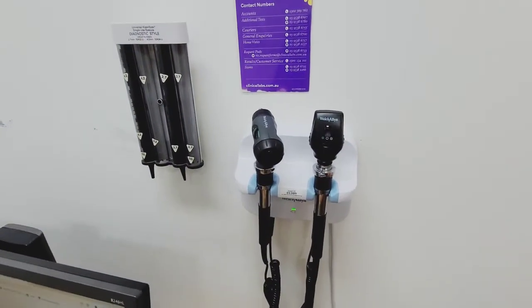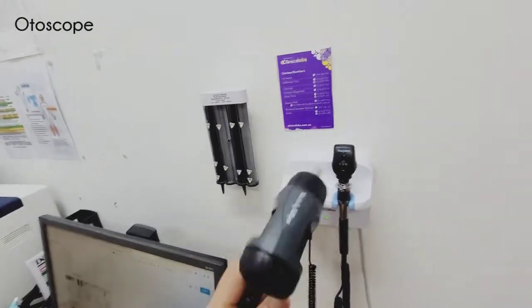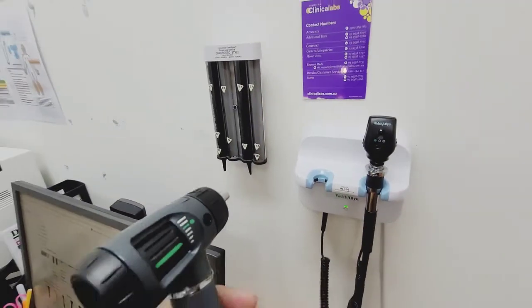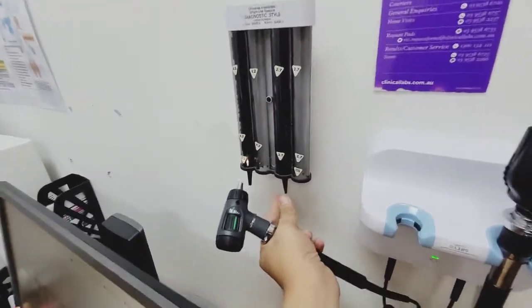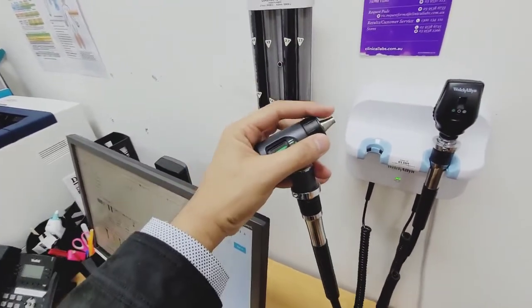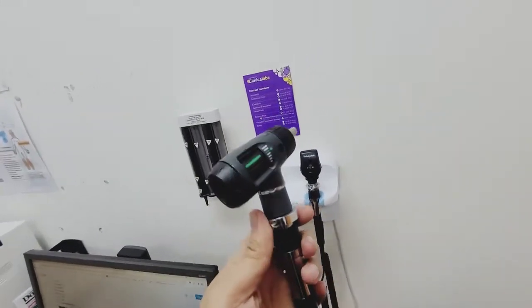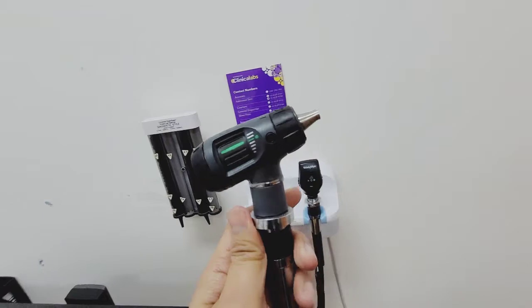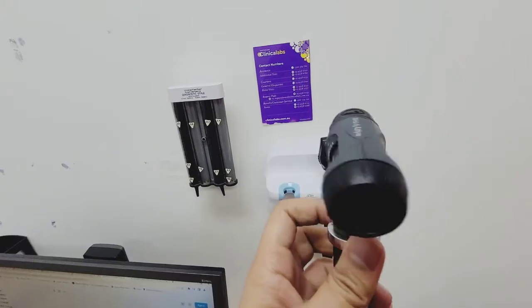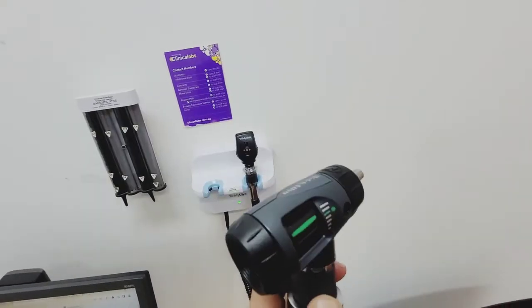All right, guys, this is what we call the otoscope. As you can see, there's a light there. So what we usually do is we grab one of these and attach it to here, and then the otoscope is used to get some visualization of your ear canal or eardrum. We use the light to have a look at the inner parts of your ear.